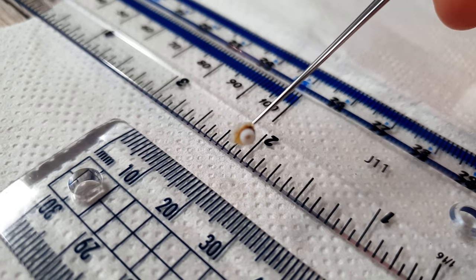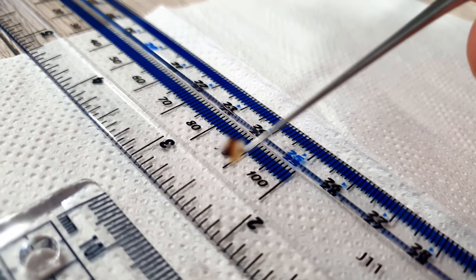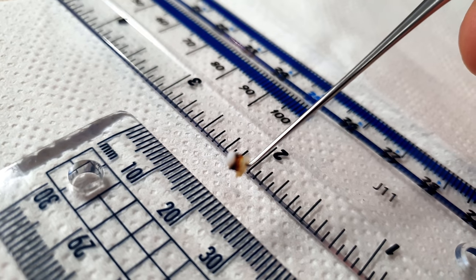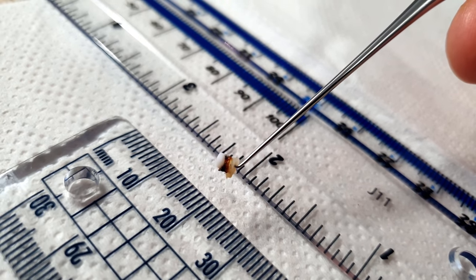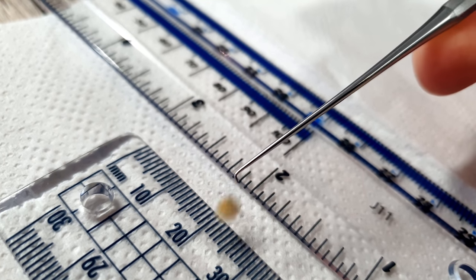I have referred this patient back to the surgeon who originally put the grommet in, so hopefully this patient can get it sorted. There's the grommet — from end to end it's probably three millimeters, incredibly small. They're meant to fall out and be extruded after a certain amount of time.